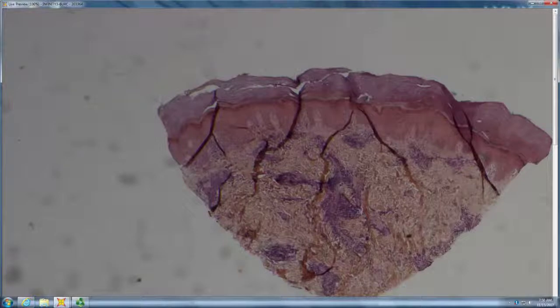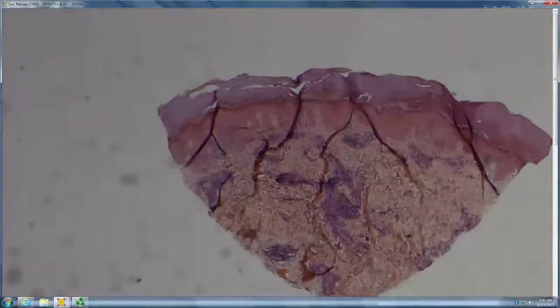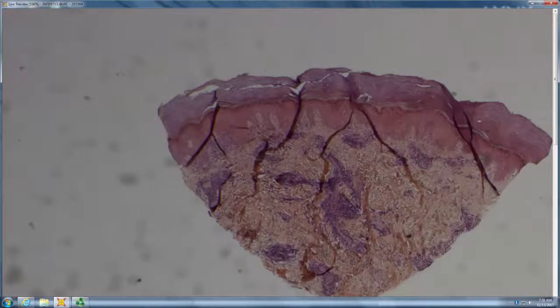So endothelial swelling, no lumen there, so it could be Wells syndrome. Yeah, absolutely. So this is a Wells arthropod type of pattern. You've got a huge flame figure, but really no palisading granuloma around it. So it borders right on collagen. In Churg-Strauss, it would border on a thick border of histiocytes.